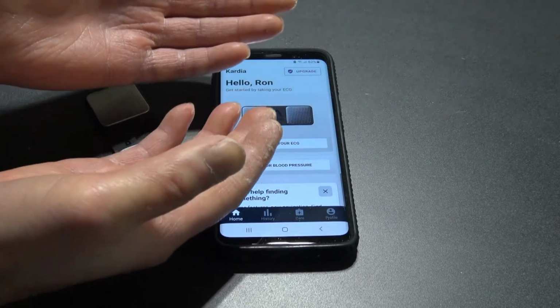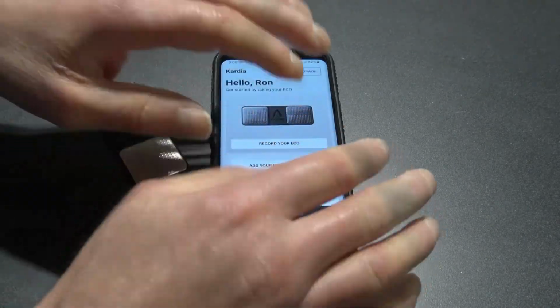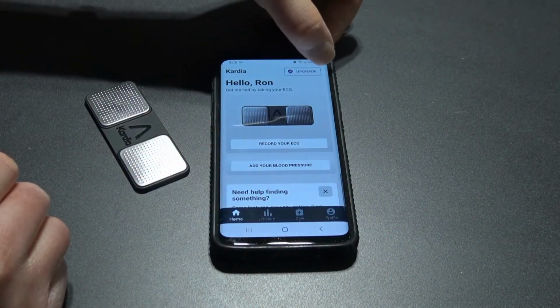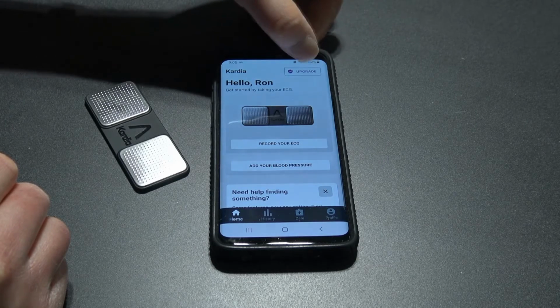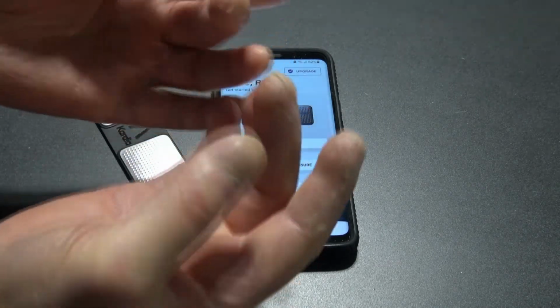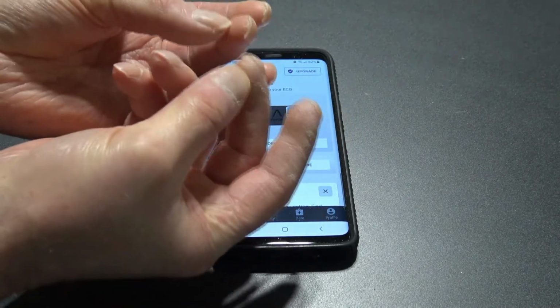My hands are really dry from the scleroderma. See that? Dry there. The only way to get a good reading, you'll see up in the upper corner, make sure you always have three bars, is to wet your fingertips. I don't use two fingertips, I use these two here. These two fingertips here I use.